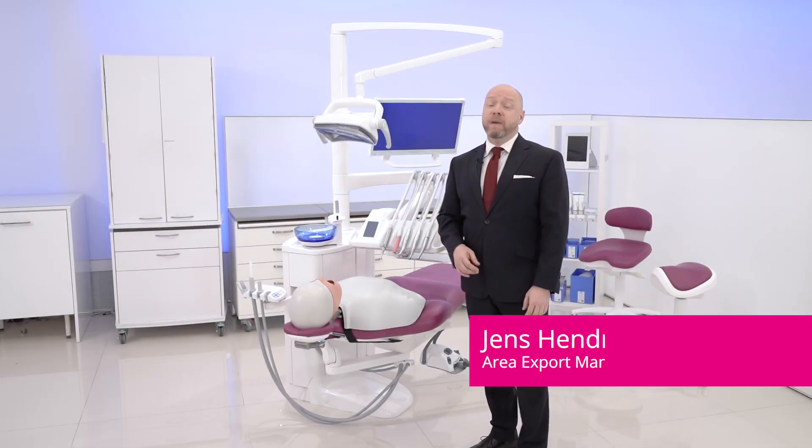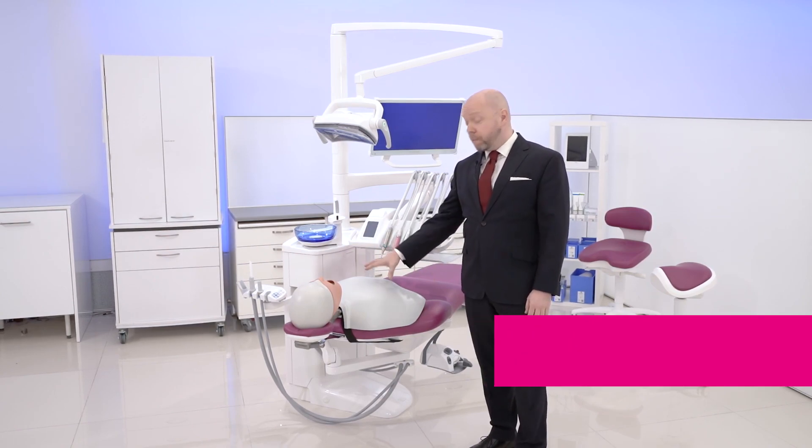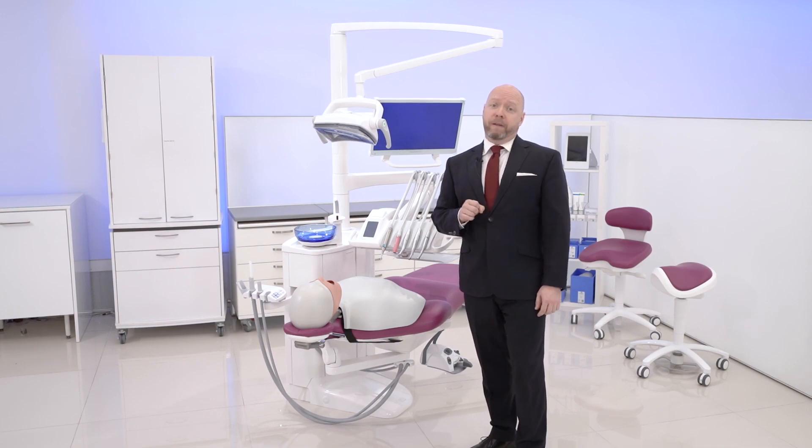Hello, my name is Jens, and I've been given this opportunity to give you a brief overview of our most popular dental care unit, the Planmeca Compact i5.